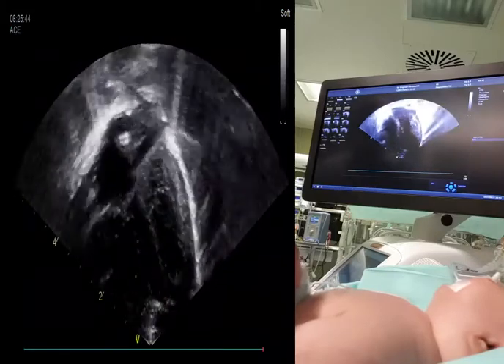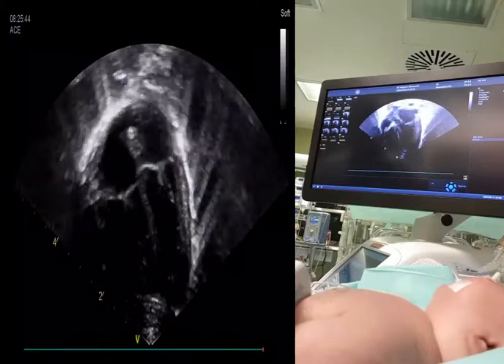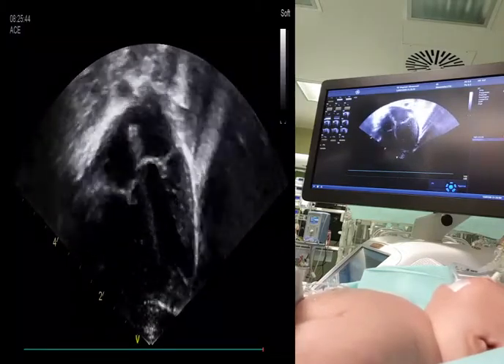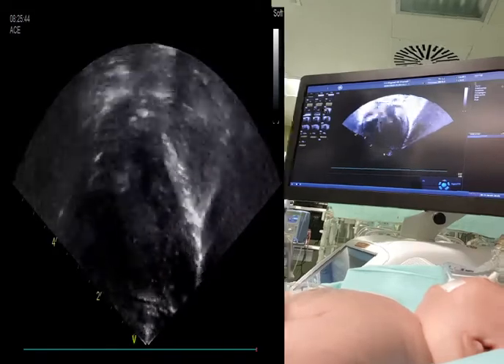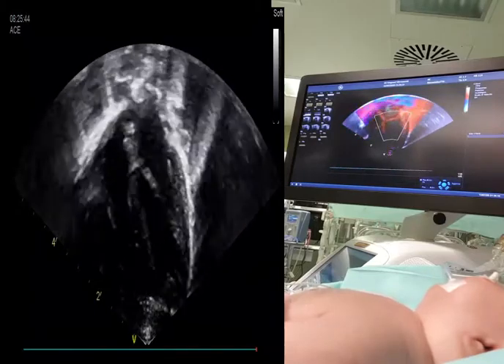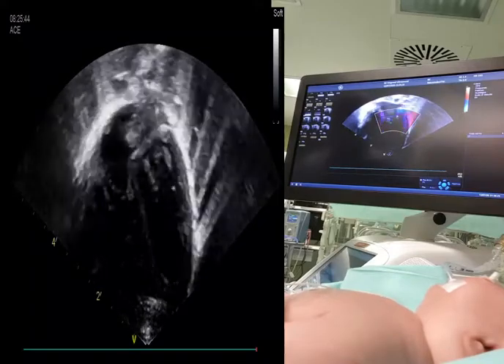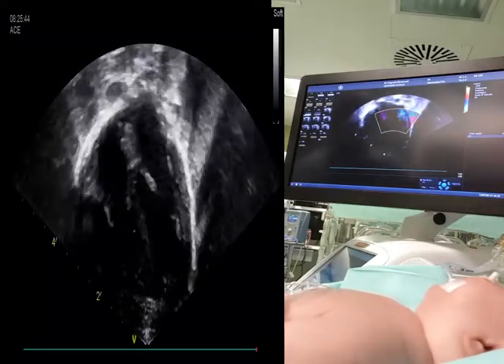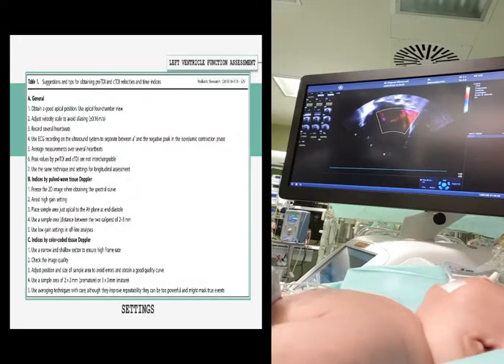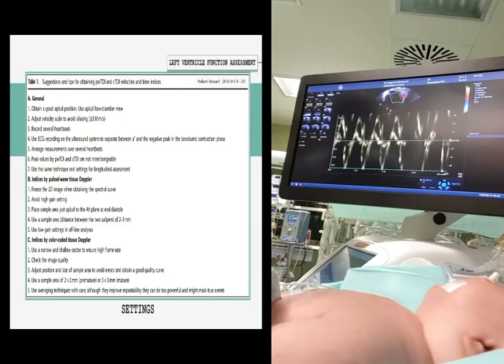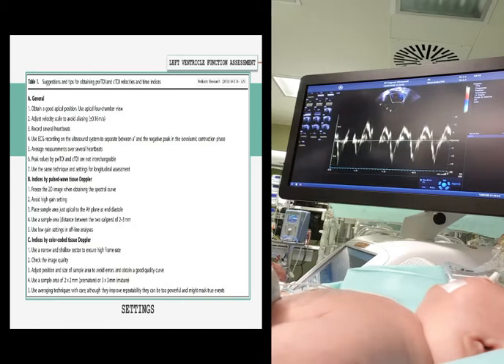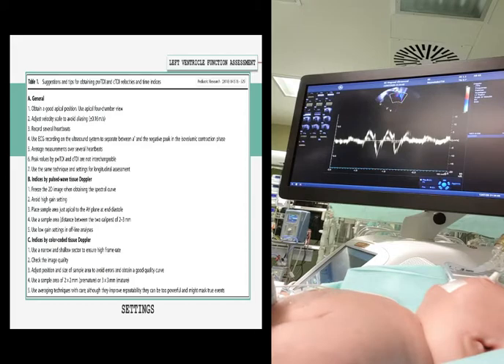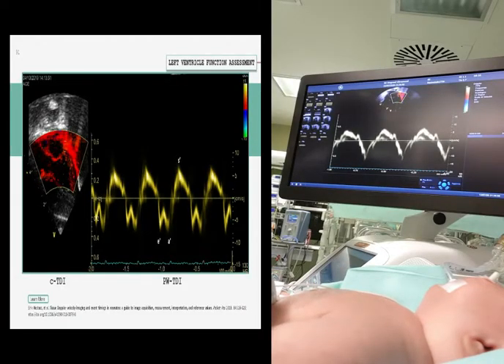During the cardiac cycle, the atrioventricular valve moves toward and away from the apex. This longitudinal deformation can be best assessed by interrogating longitudinal annular velocities of the atrioventricular valve and interventricular septum using tissue Doppler imaging in the apical four-chamber view. There are two basic tissue Doppler imaging techniques: pulsed wave tissue Doppler and color-coded tissue Doppler. The user can use velocity-time curves by both techniques to measure peak velocities and time intervals. For pulsed-wave tissue Doppler, it is recommended to place the stationary sample area just apical to the atrioventricular plane at end diastole. To obtain reliable measurements, it is important to use a low gain setting, a sample area of 2 to 3 millimeters, a velocity range of ±0.16 meters per second, and an angle of insonation less than 20 degrees. Using pulsed-wave tissue Doppler, a velocity waveform is generated.